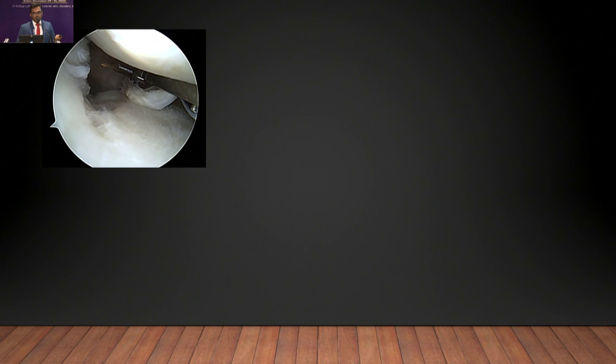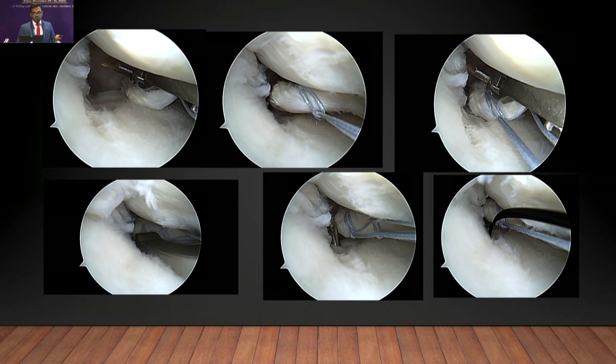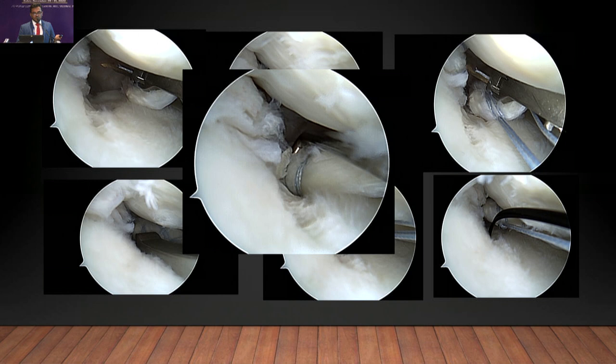These are a few steps. You take a bite with the knee scorpion with a few threads and take at least two sutures in a cinch type of fashion. Prepare the bed and drill the tunnel. Then shuttle through the tunnel and get the fiber tapes or suture fibers onto the anteromedial aspect of the tibia, and get a good repair.